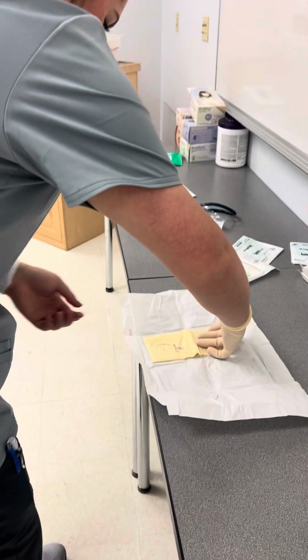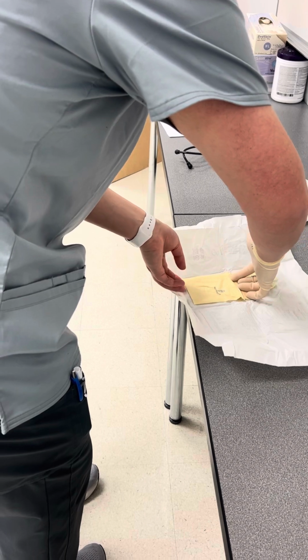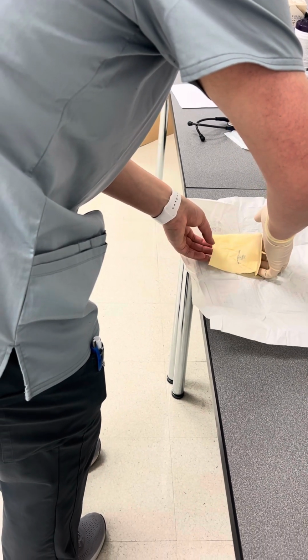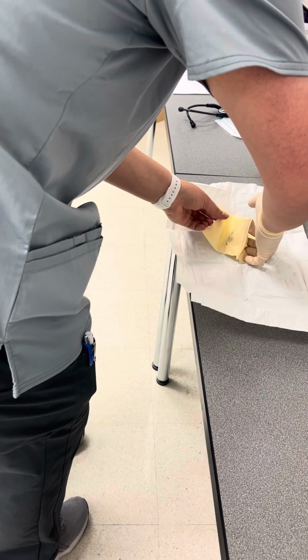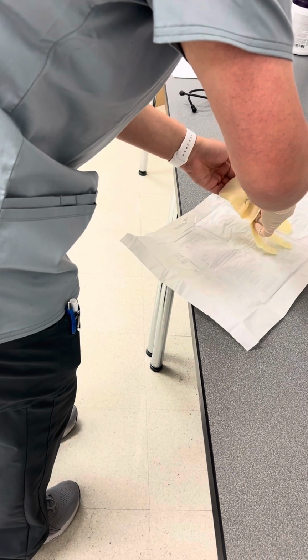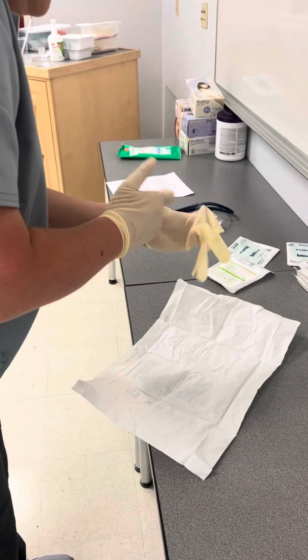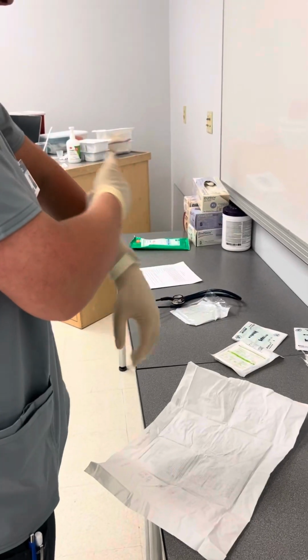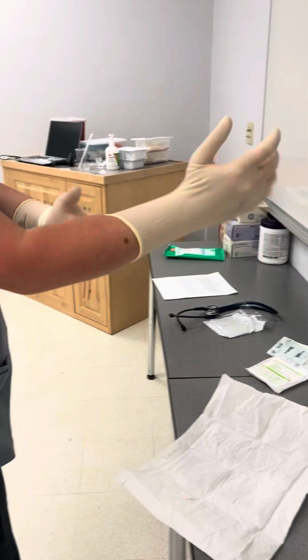And then I'm going to go under the cuff in second hand. I'm just going to fix this cuff.